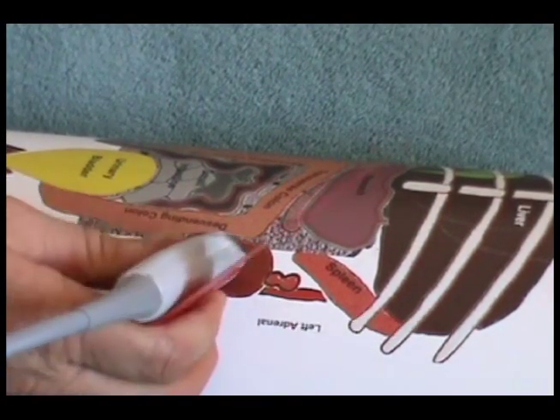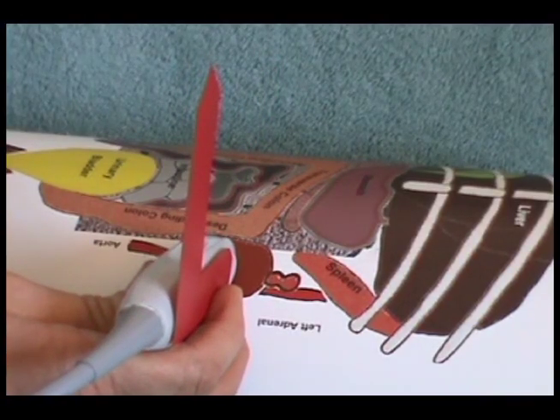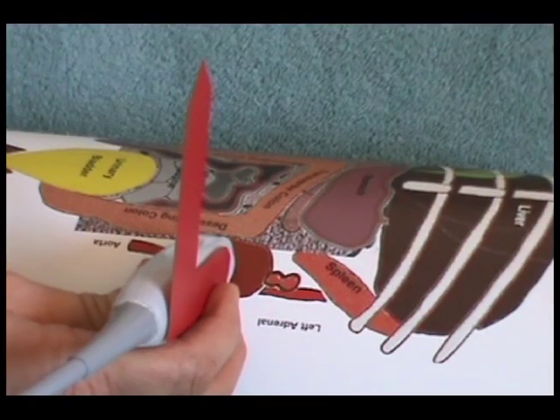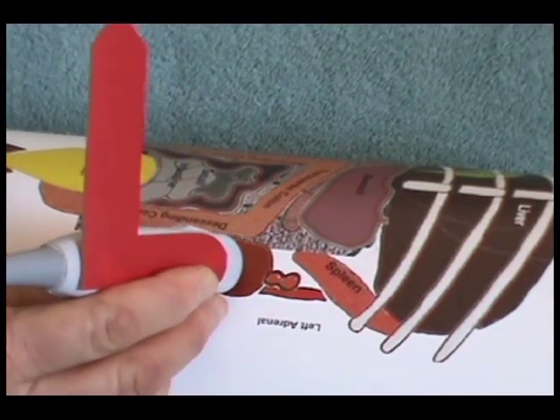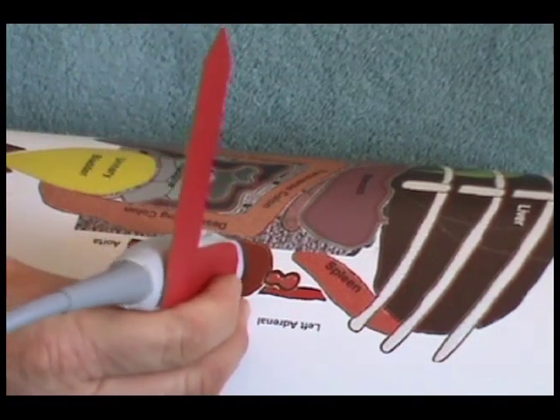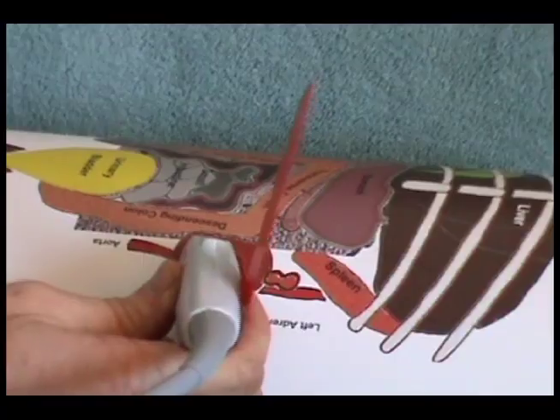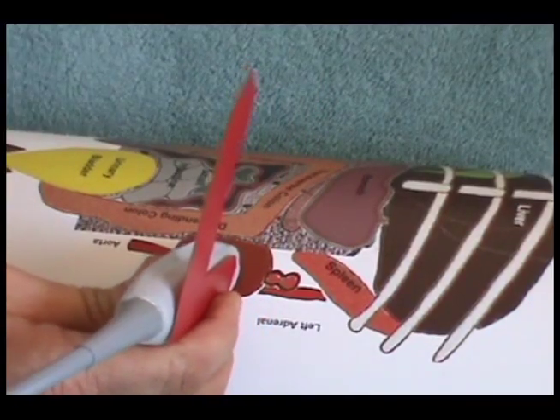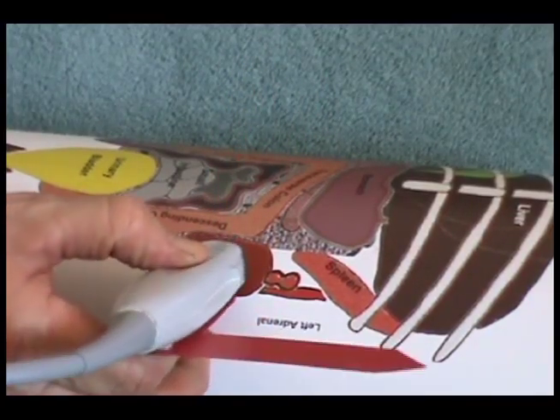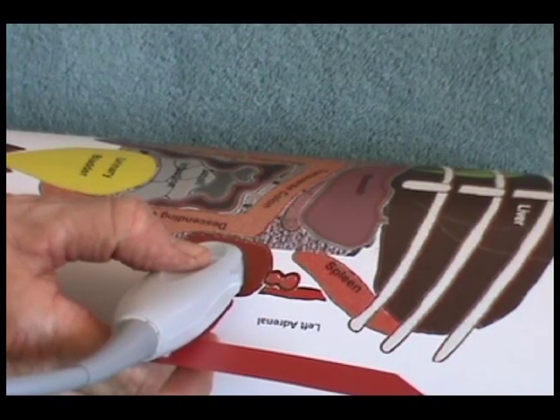Rotate the transducer 90 degrees counterclockwise to a transverse position. Fan cranially and then caudally till all kidney tissue has been seen. Rotate the transducer 90 degrees clockwise back to a left lateral sagittal position over the left kidney.